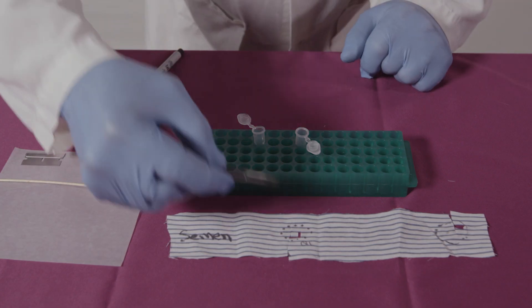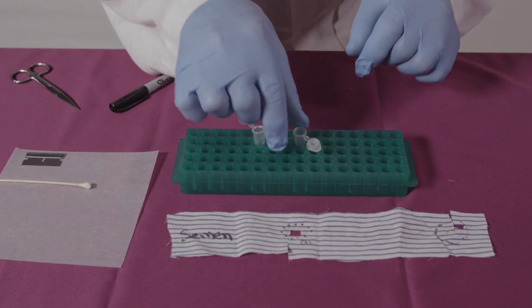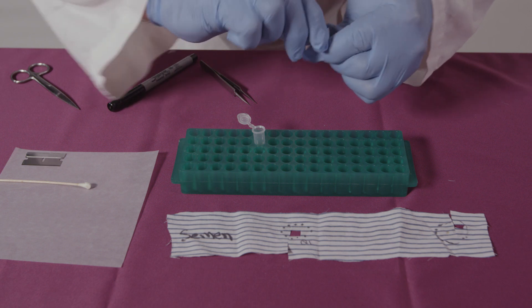Prepare an extract of a stain by cutting out a five millimeter by five millimeter area and place the cutting in a clean microfuge tube and label.